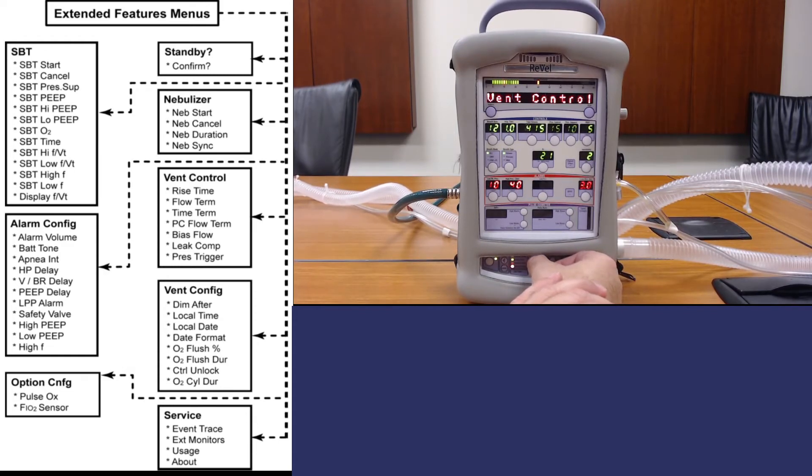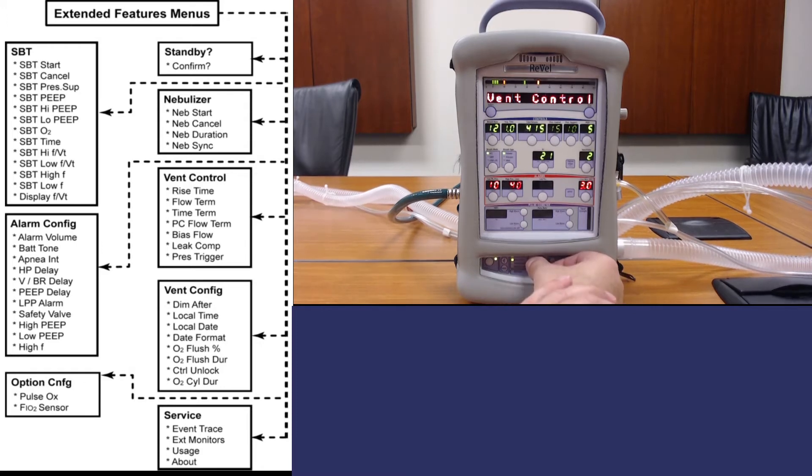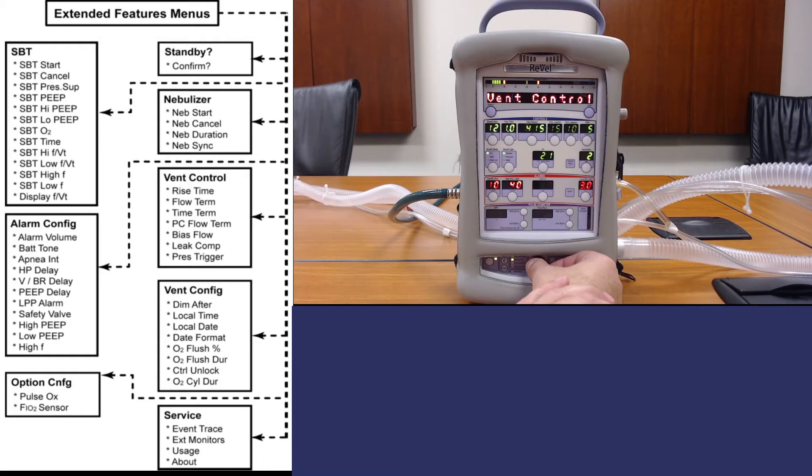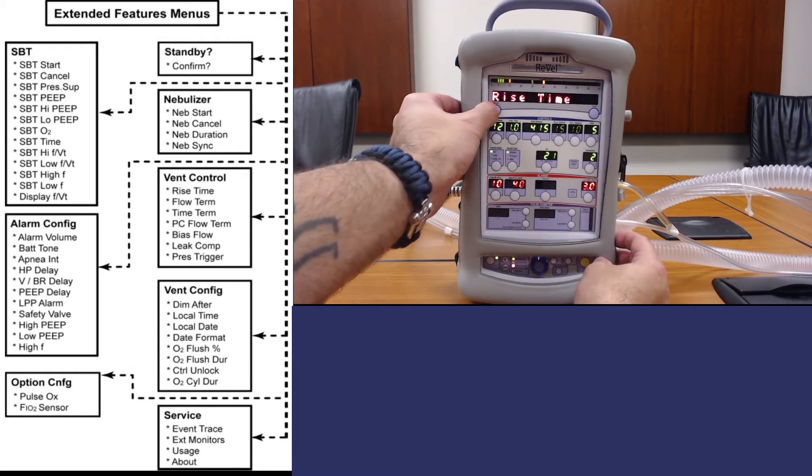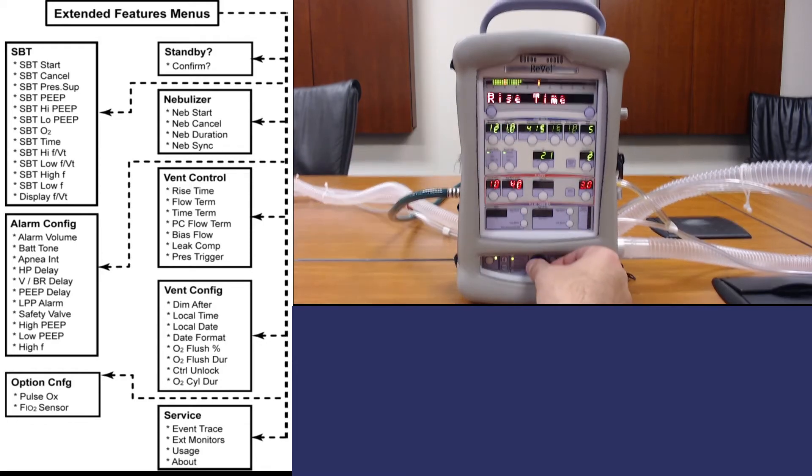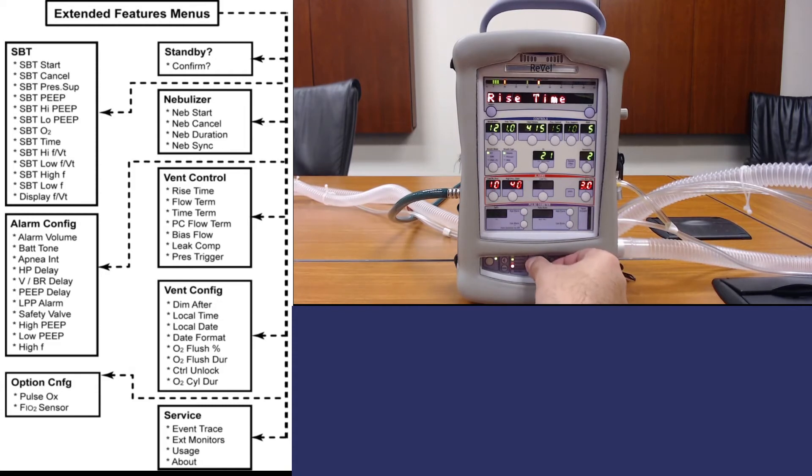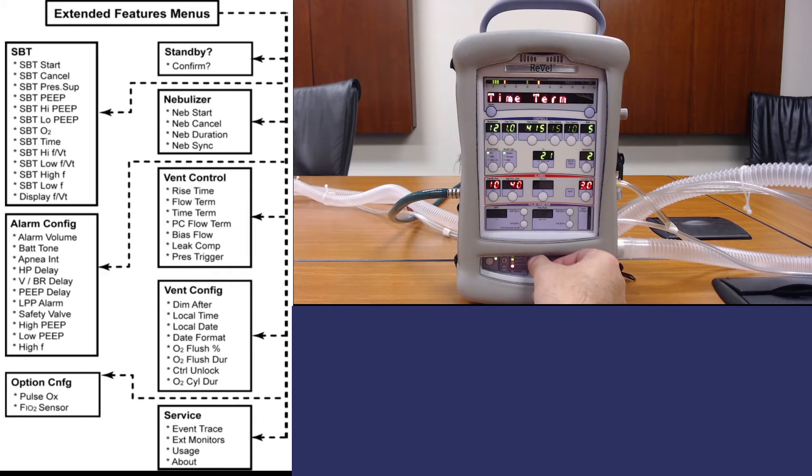Vent control is the other menu that we're going to access fairly frequently. This allows you to configure the rise time, flow termination, and time termination.